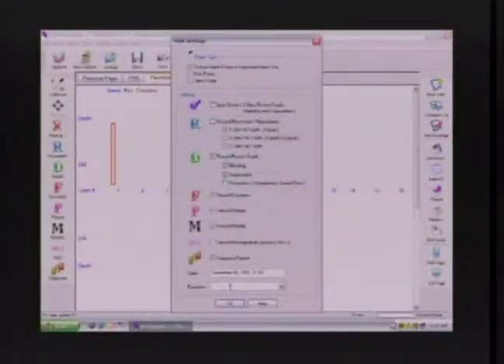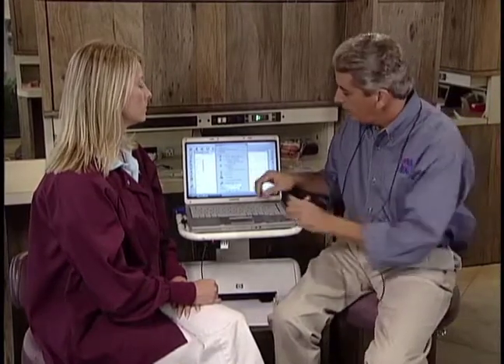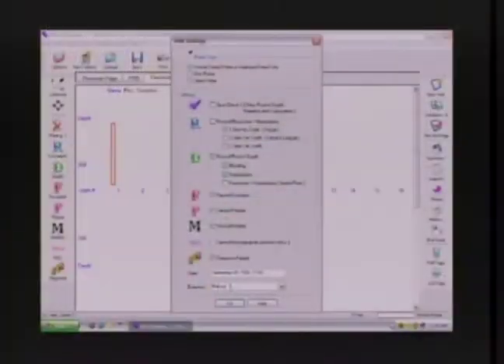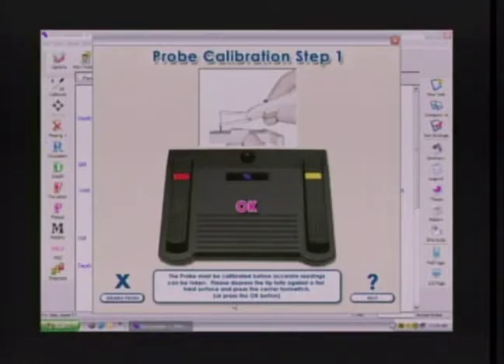And once I put in the examiner, once in an individual room, I'm just going to use your first name here. I want to put this in as I would want it printed on the printout. But once I've put it in each workstation once, it will always be available from this drop-down menu. At this point in the exam, when I click on OK, I'm finished with the keyboard and mouse.